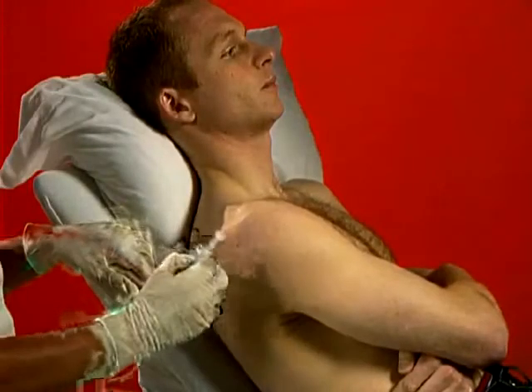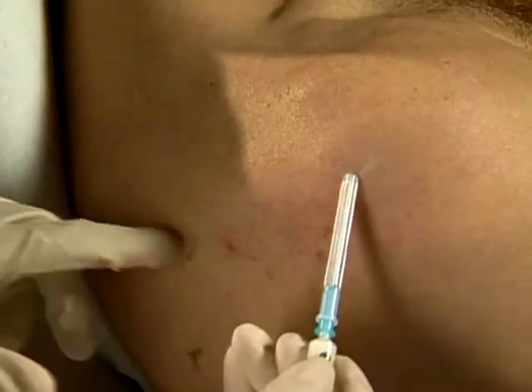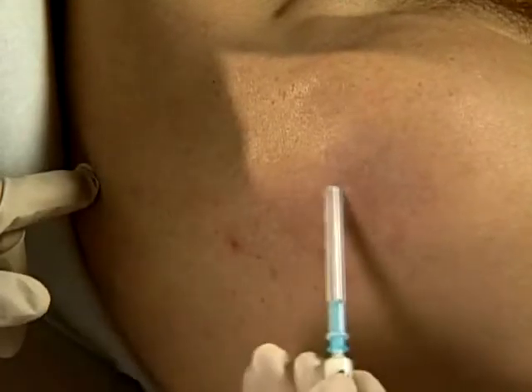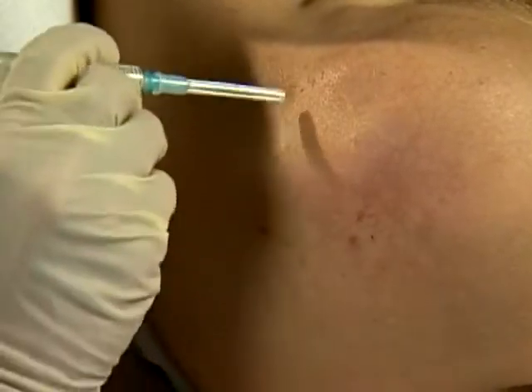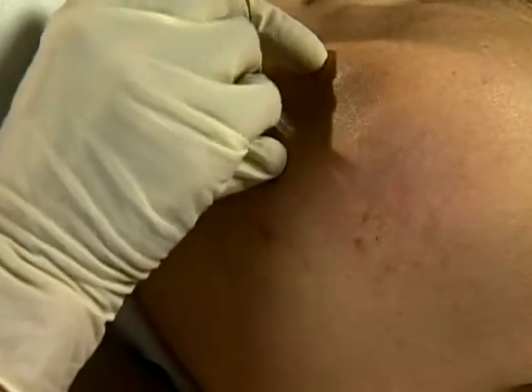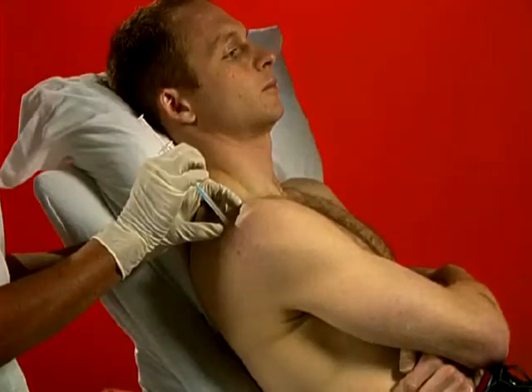Locate the lateral border of the acromion and the spine of the scapula. Mark entry point 1/3 along the spine and 1 finger width superiorly. Clean and firmly stretch the skin and rapidly insert needle perpendicularly. Pass slowly down to bone of fossa and inject as a bolus around the nerve.